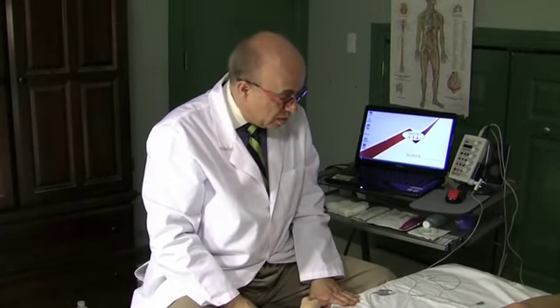Now, if a patient is coming to you with a recent herniated disc, none of these things might show anything, but the patient might have a lot of symptoms. Under those circumstances, I study the neck muscles. The neck muscles are called the cervical paraspinals, and they will show early changes before we see changes in the extremity, in the arm. And we study the low back paraspinals, which show changes before we see changes in the leg.